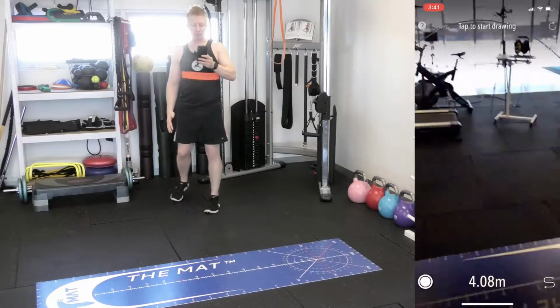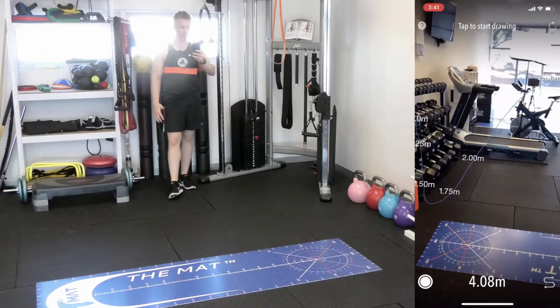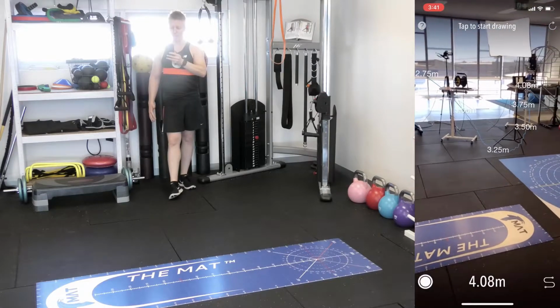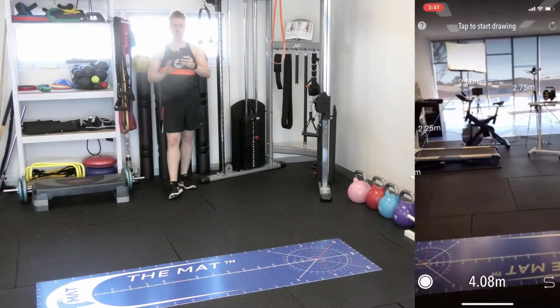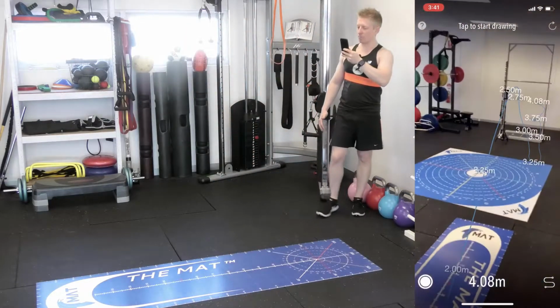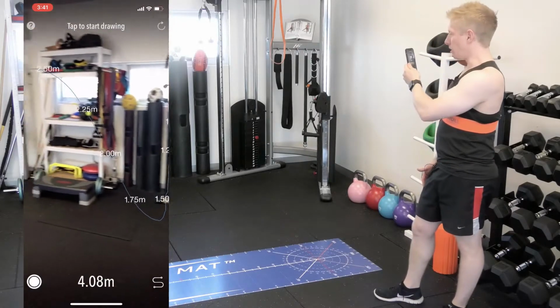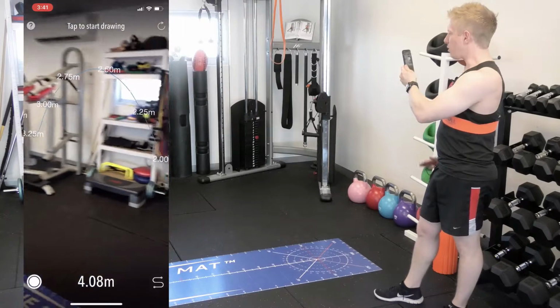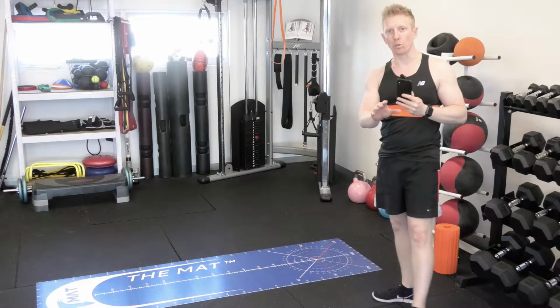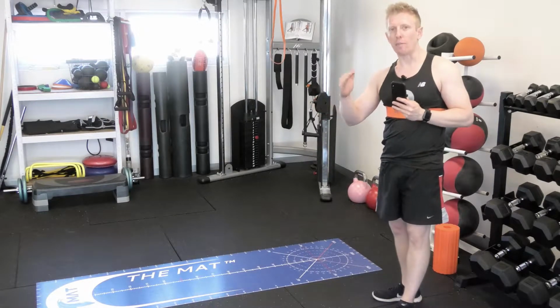And what we'll see as I move back is a displacement measurement when I performed the hop test. And so what you'll see is that flight phase mapped out really nicely. While the distance measurements might not be accurate, the trajectory measurements are really nice to start to have a look at. And you can move around, you can have a look from all sides, and that will stay there in space. And look at those measurements that you've just performed and give you a bit of a look at the trajectory. You can then go ahead and compare to the other side as well. So a really useful tool to start to use to give you some qualitative information about that trajectory.